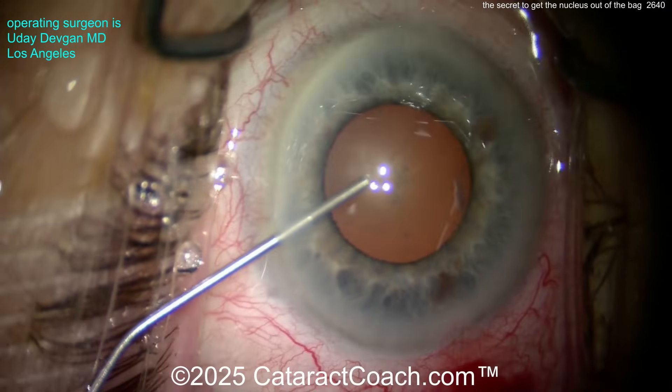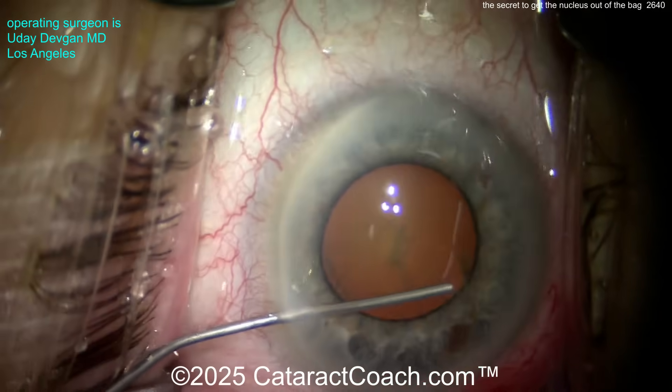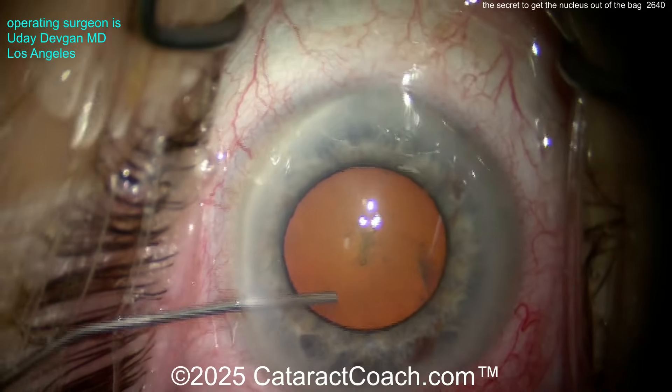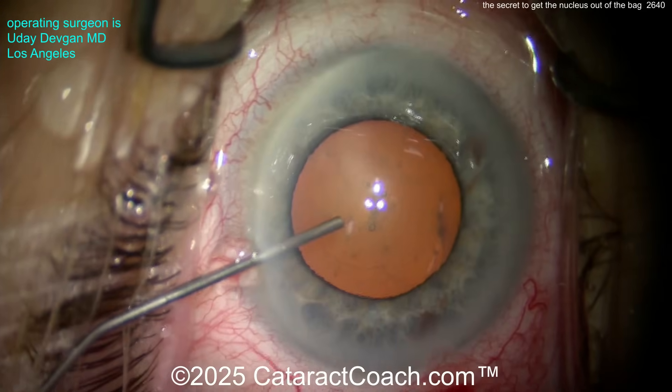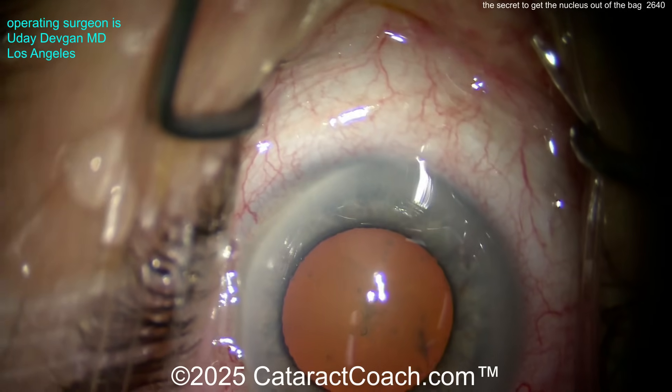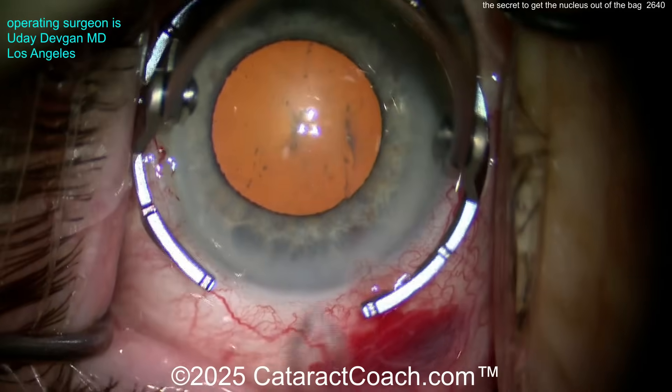But here's the big trick: it's Osher's viscomedriasis. Injecting viscoelastic to push that pupil margin temporarily out a little bit to give you a little bit more of an expanded pupil. And that's a much better pupil size — but it's temporary. As you remove the viscoelastic, you're going to lose that. Now we're going to make our main incision here.